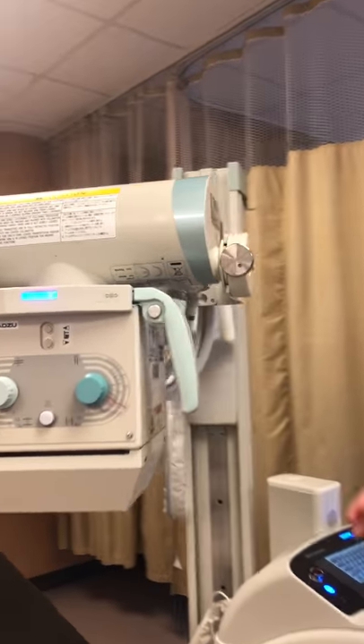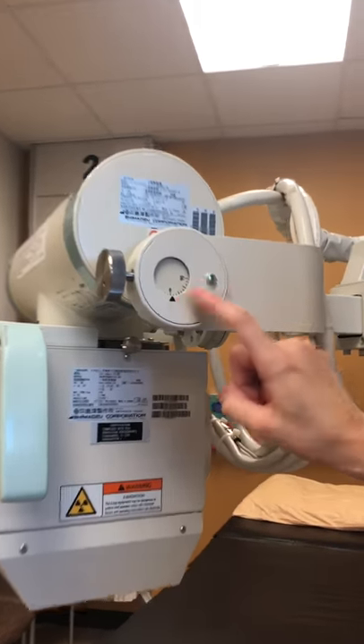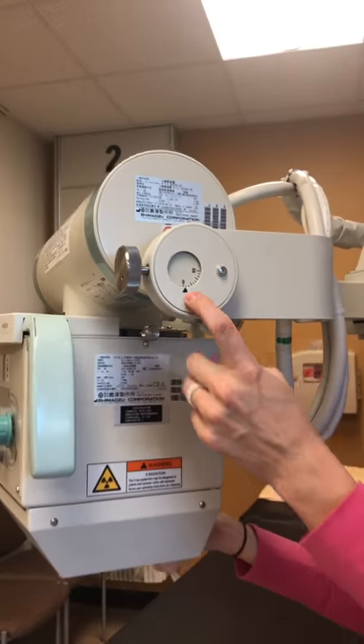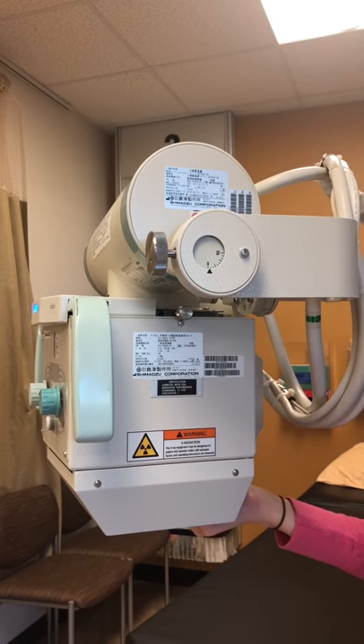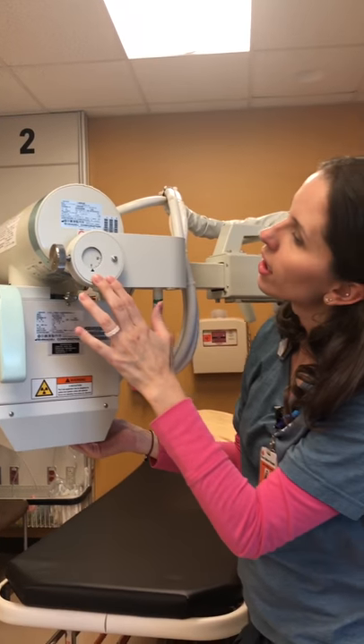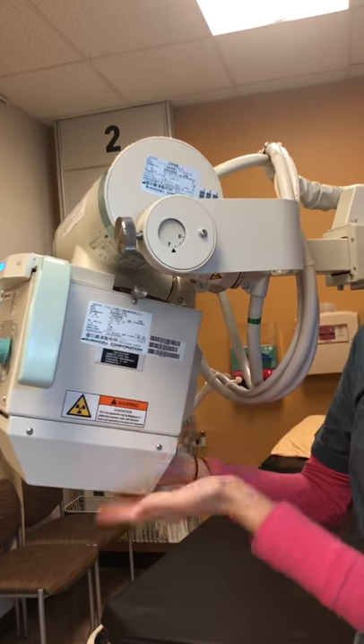Now we're going to talk about angulation. There are two different angulation sets and meters on your portable. Right here is one, and it's very helpful to know that you're at a perpendicular beam to a table, desk, or whatever you might be taking your X-rays on. If you need any sort of angle, you can just push the collimator leaves this way.